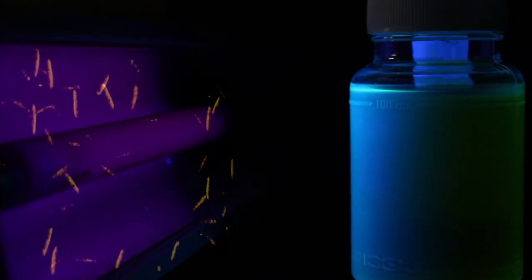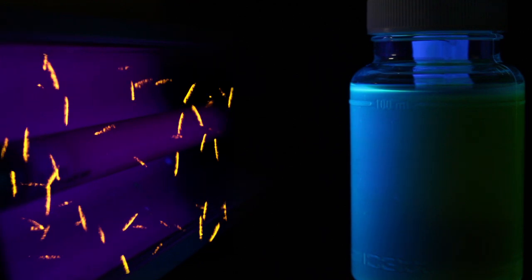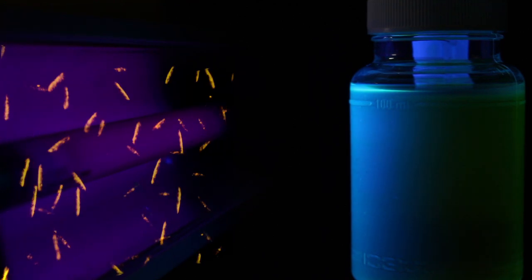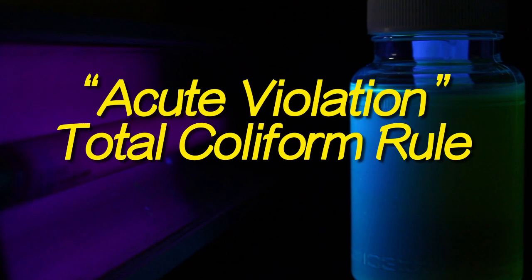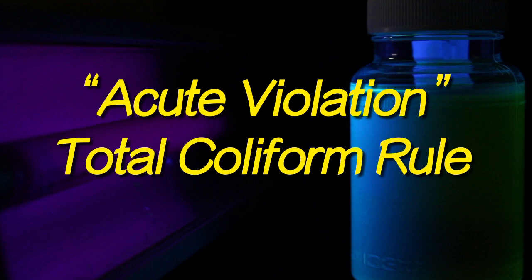If the blue color is evident, the sample is not only positive for total coliforms, but for the more critical E. coli as well. This could lead to what is called an acute violation of the total coliform rule.